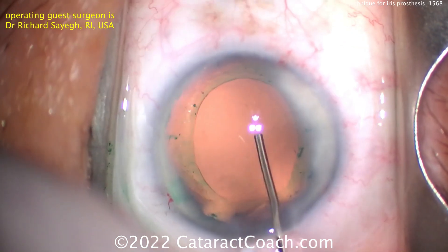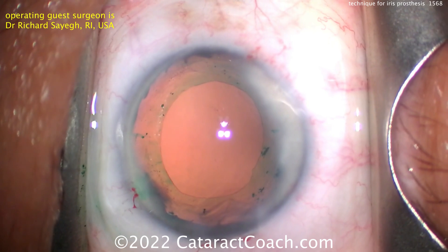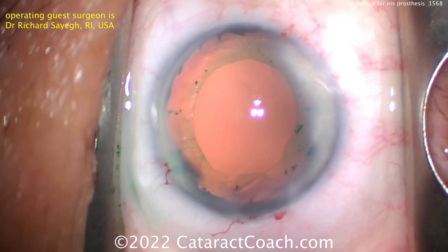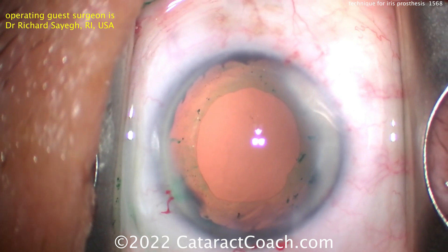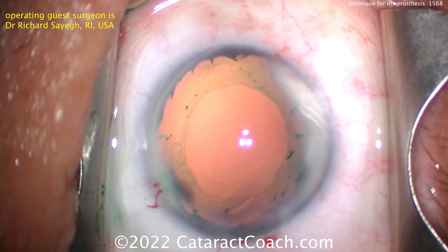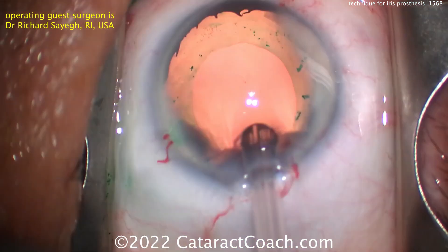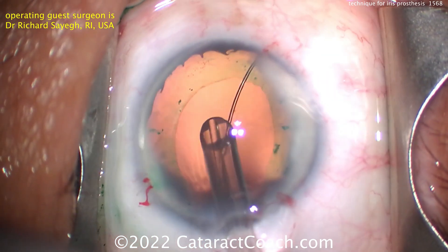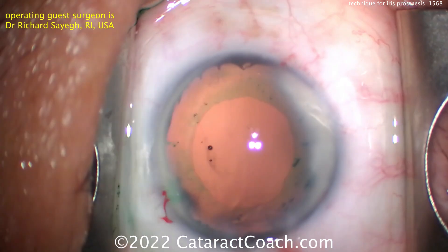In this case, the cataract has already been done. There's very little iris tissue remaining. The capsule has been stained, but not with TriPan Blue — it's been stained with ICG, Indocyanine Green. The reason is that TriPan Blue does stain the capsule but makes it a little less elastic and more fragile. Using IC Green, you're able to get the capsule stained while keeping it flexible.